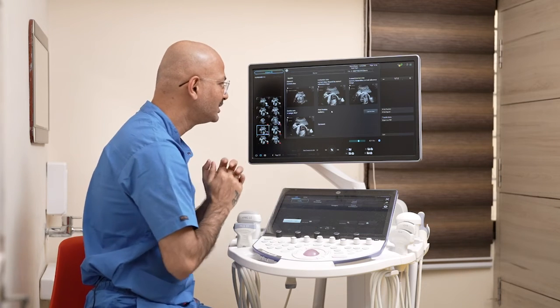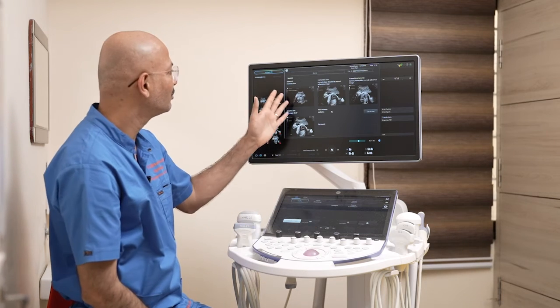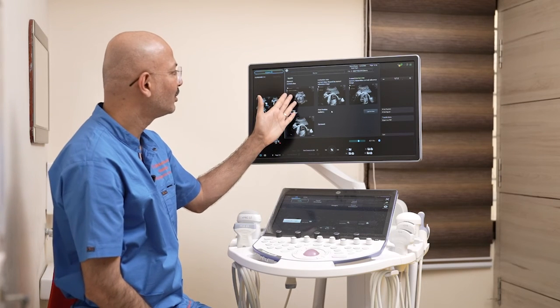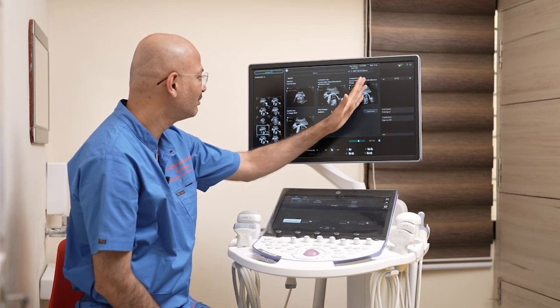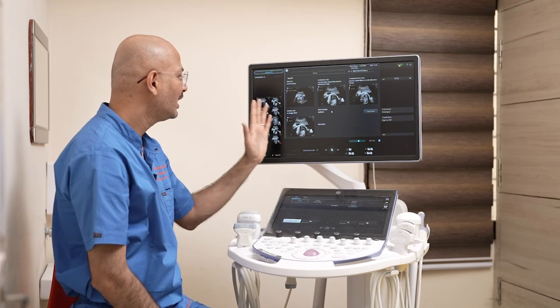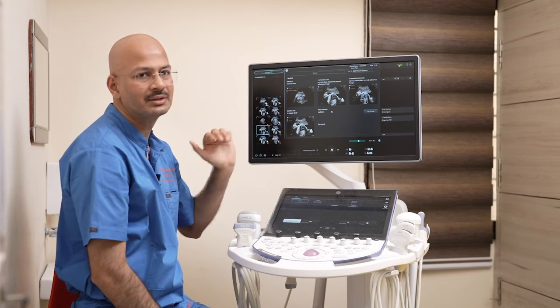Now the report has been generated along with the normal situs, four chamber, three vessel, and the cardiac axis.